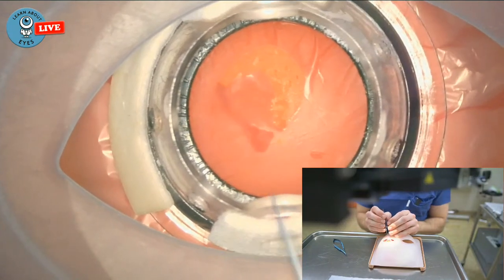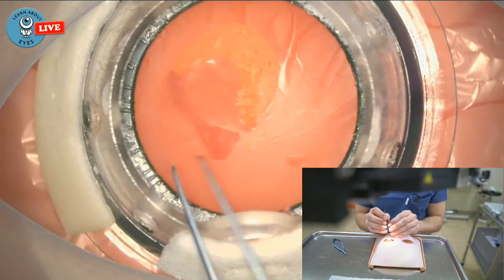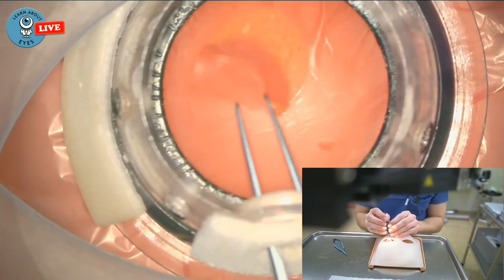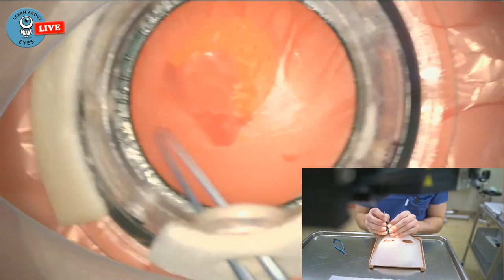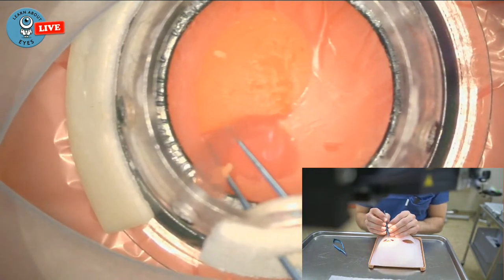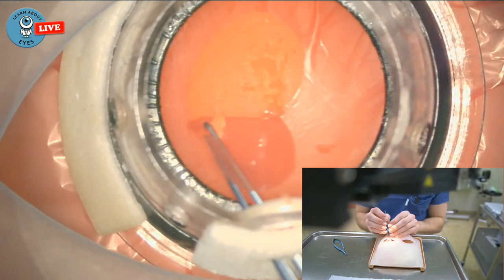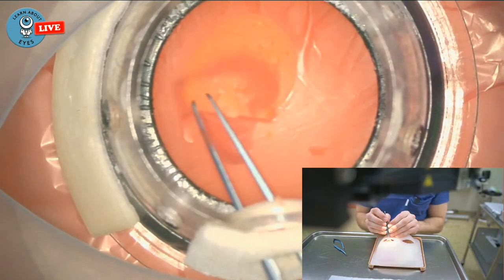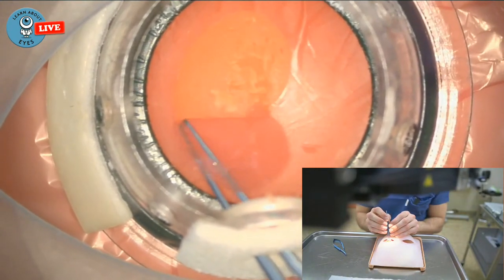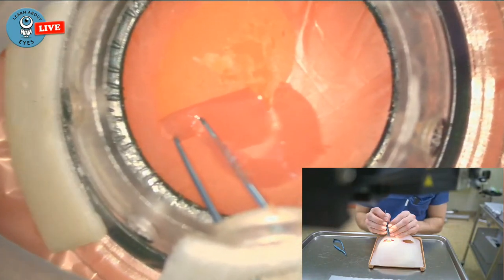Okay, so it's running out this way. Can you see? Hopefully it's... I hope it is sharp enough. So it's kind of running out this way. So what you can actually do is pull back the other direction. So you can flap it back, grab it close, and then pull in the other direction. This doesn't work all that well with this because it's not at all elastic. But can you see, if I zoom in?